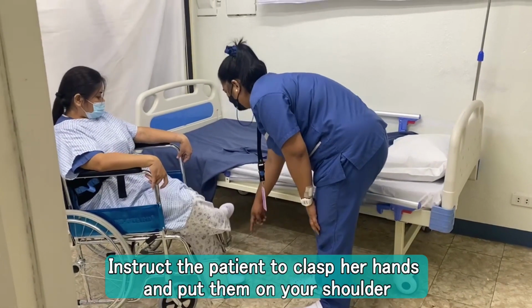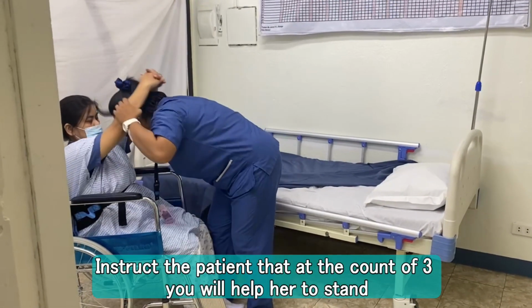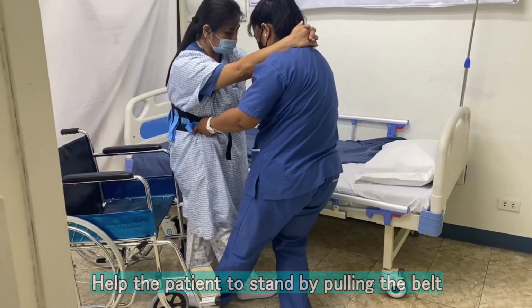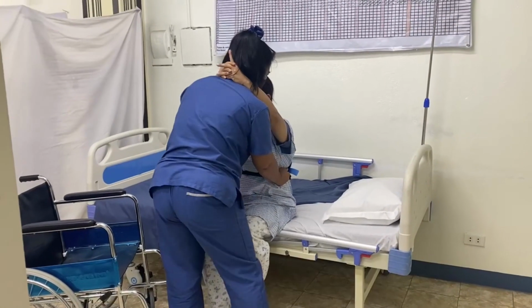Instruct the patient to clasp her hands and put them on your shoulder. Instruct the patient that at the count of 3 you will help her to stand. Help the patient to stand by pulling the belt. Instruct the patient to move her right leg first and you move the left.